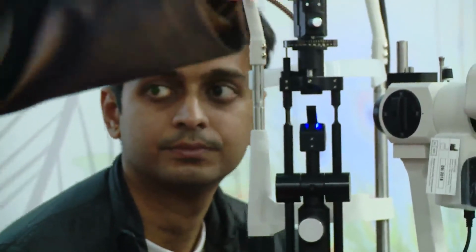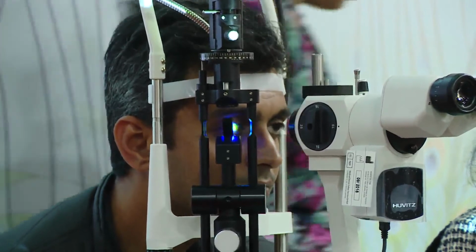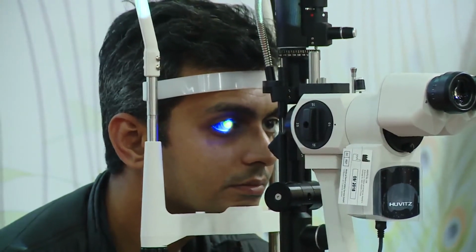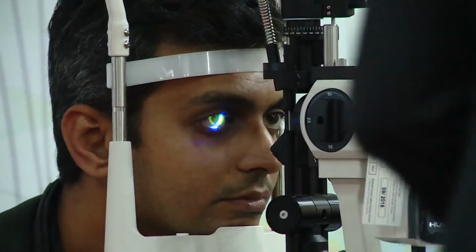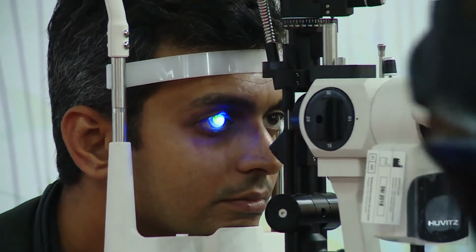So we just turn the lights off again if we can. I think we can try without lights because it takes a lot of system setup if we have to switch on and off. Jyoti, just move the slit to the other side. I think we can do better to see it like this, or still more angled. I think that's not going to work. Let's just forget it. Let's just use the screen here.